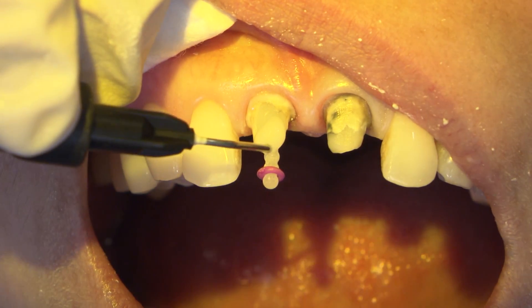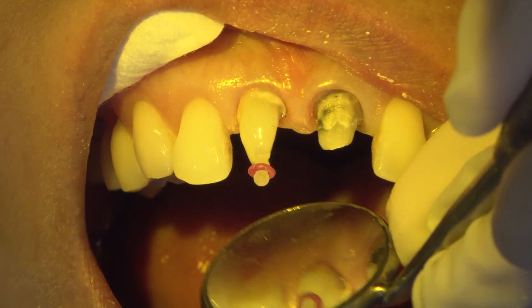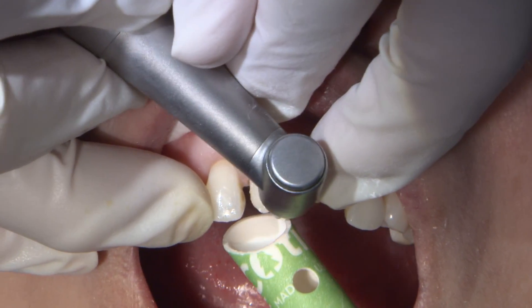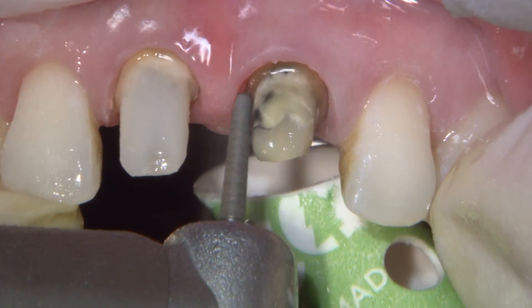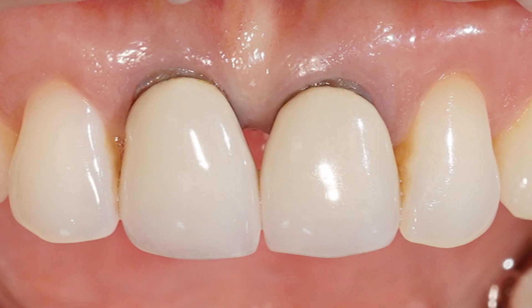For the rest of the buildup, I'm using my discontinued camouflage flowable composite. Flowable works well and has good mechanical properties, but dedicated buildup materials are going to be cheaper for these purposes. Once the composite is dropped into place, I use an explorer to pop air bubbles and tease the material into place so there's a nice transition to the tooth. Now it's back to the round end tapered diamond to eliminate the top of the post and refine the preps. I'm dropping the mesial margin apically to establish a better emergence profile for the final restorations. There was quite a large black triangle between the previous crowns — any time you want to close a space or minimize black triangles, a more apical margin position can assist you and the lab. If the margins are set too high, any attempt to accomplish the closure will be more of a ridge lap, which can have an undesirable appearance in these aesthetic areas.